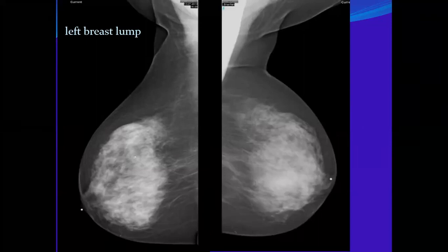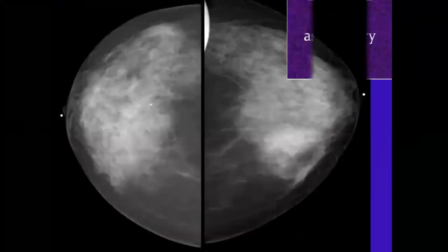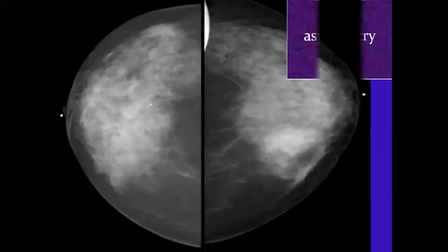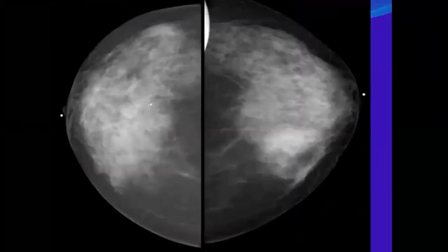Okay. Do you agree? I agree. We spent how many hours talking about the quality? Yes. This is very essential. You see? This is a suboptimal mammography, and might be the patient refused or whatever, or I brought it for that reason. Okay, this is the other view.